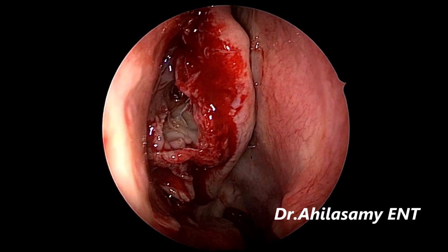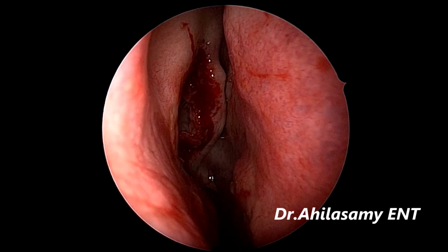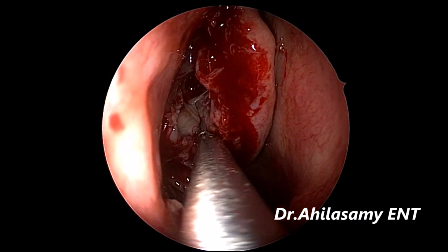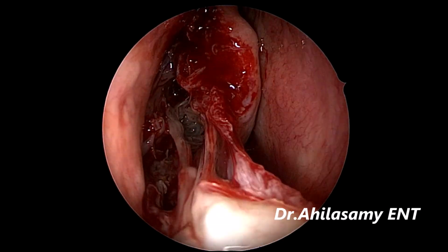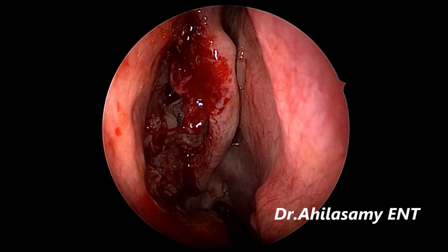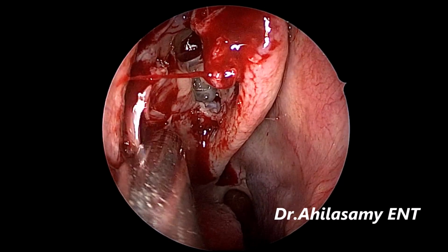Now I am taking the bulla out with the Blakesley forceps. See the quality of field, that's why I love the local anesthesia. If you give good premedication, as in this case dexmedetomidine with fentanyl IV, you will get a very good field.